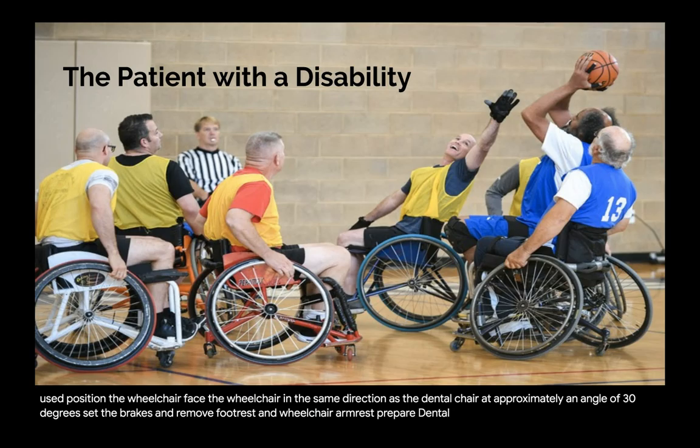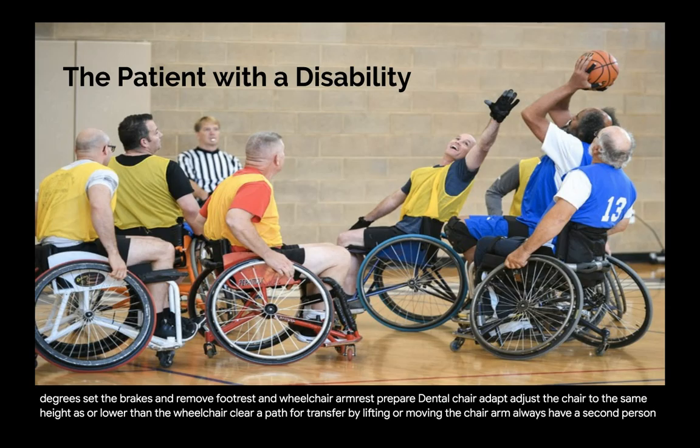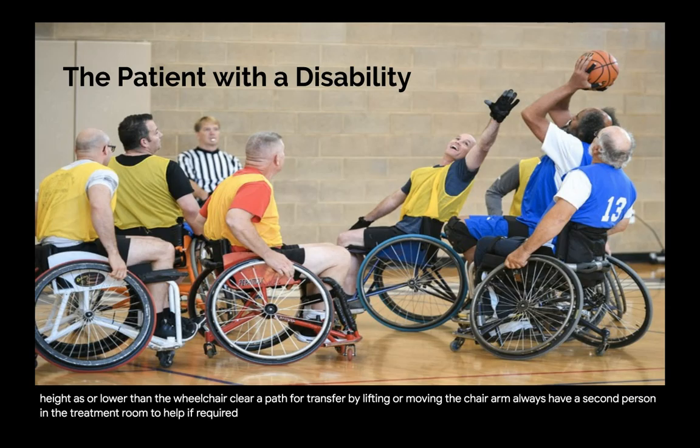Prepare the dental chair. Adjust the chair to the same height as or lower than the wheelchair. Clear a path for transfer by lifting or removing the chair arm. Always have a second person in the treatment room to help if required. Approach the patient. Support the person while detaching the safety belt if present.